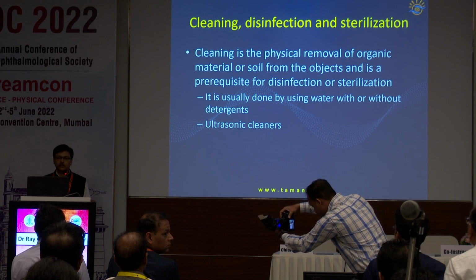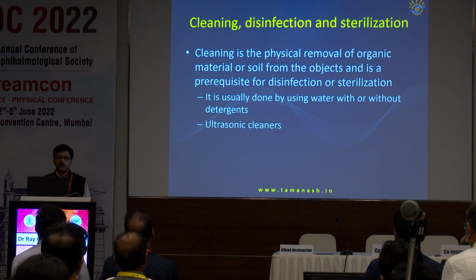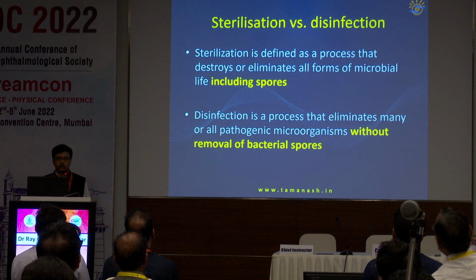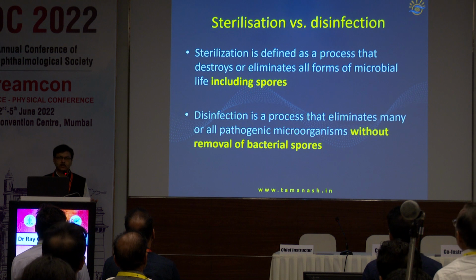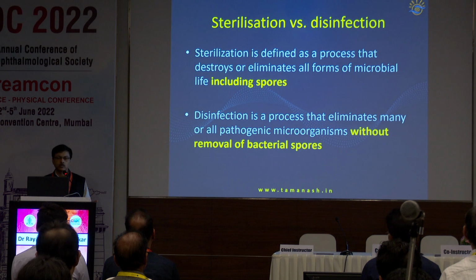And I'm very happy that the previous speakers have underlined and stressed the need for cleaning, because cleaning is the physical removal of organic material or soil from objects and is a prerequisite for disinfection or sterilization. So sterilization means removal of all germs, microbes, including their spores, and disinfection is killing of the bacteria and fungi without the removal of their spores. So that is the difference. So when we are doing sterilization of the instruments, it is a sterilization and not a disinfection, because removal of spores is equally important.